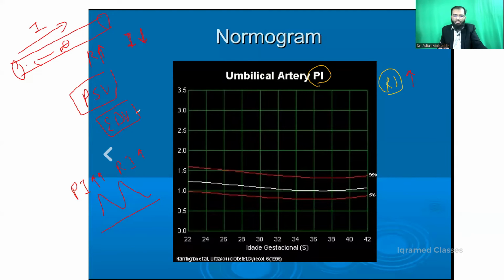Okay. Now this is the color box which has been kept. Can you see this pulsatile? These two vessels are pulsatile, the blue in color, they are pulsating. Okay. So now, just now, one of the students had asked me a question: which Doppler will you use? Will you use a color Doppler or will you use a pulse wave Doppler? It's better to use color Doppler, right? Use color Doppler.